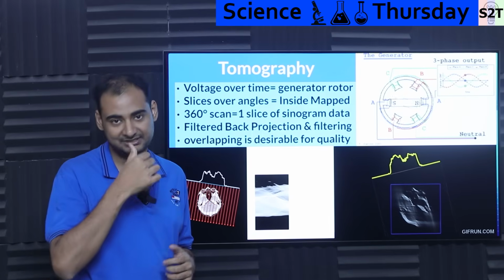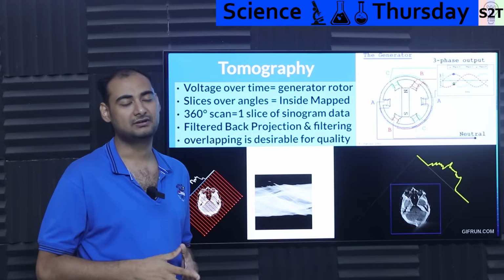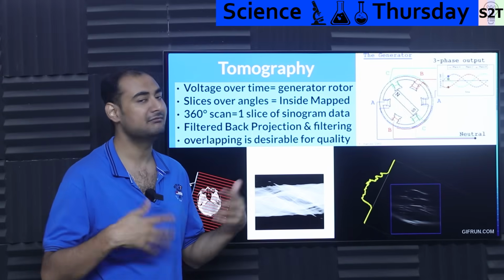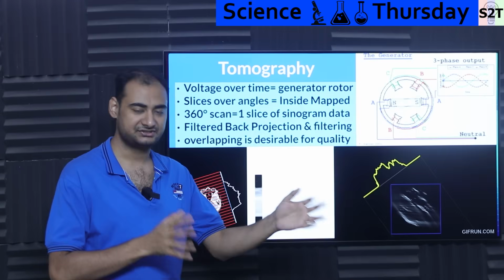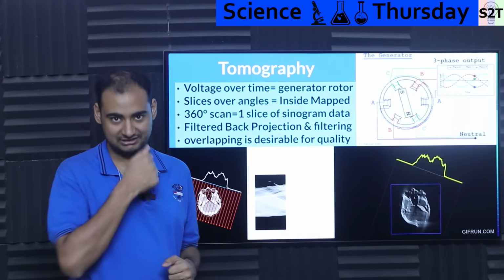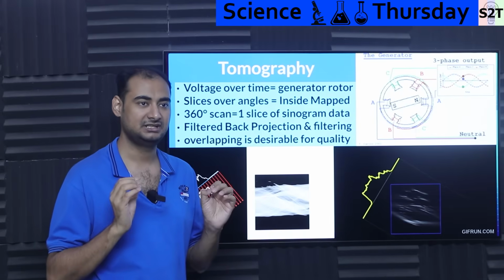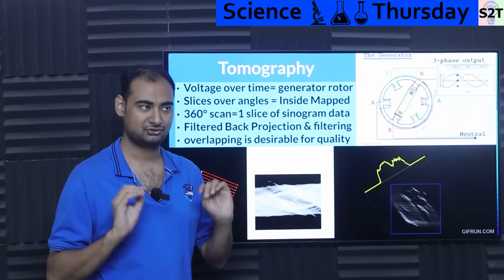Plus, overlapping is desirable. Now, be mindful, mathematically, it's a very hard problem to solve how you have overlapping, but it's desirable, and we have much better computers now. So there is generally a lot of overlap, and the benefit of that is you can just yeet the patient through as quickly as possible. Because again, we are dealing with X-ray. You want the patient exposure time to be minuscule, negligible.